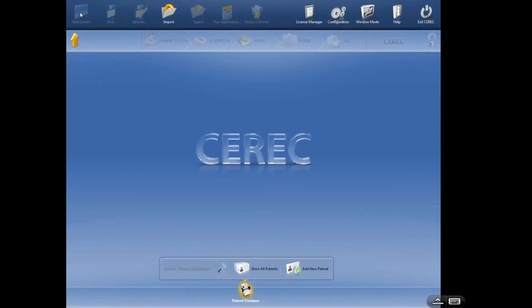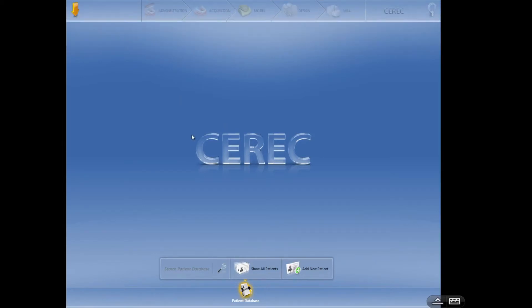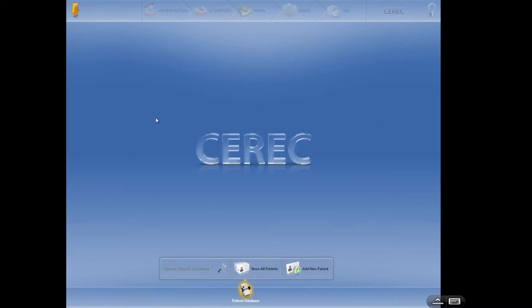Start screen — this is if you're already in a case and you click on it, it takes you back to this landing page. Now let's talk about Save. This is a really important feature that I think a lot of us don't use enough. When you start to do big cases — multiple crowns, veneers, inlays, onlays, or a single bridge — I like to use this after I've done any majority of editing and hit save. The reason is if the software crashes, it usually happens after I've done all the fine-tuned editing and I lose everything back to the images. So once you've done any number of edits — shaping, re-contouring — roll up here and hit save.